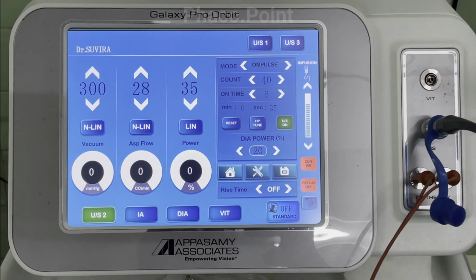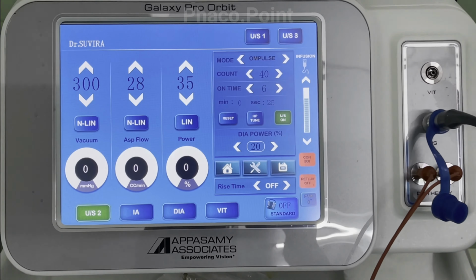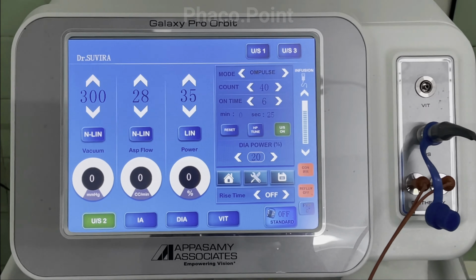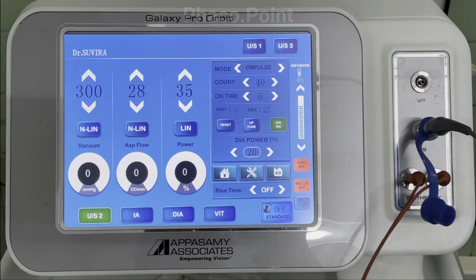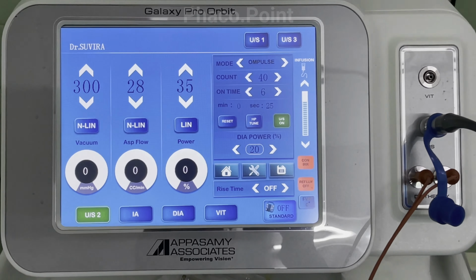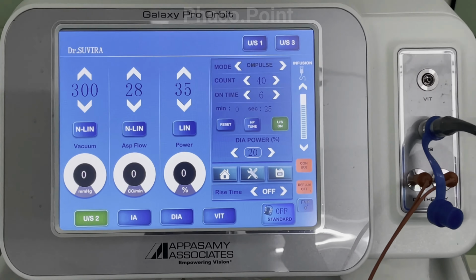Furthermore, let's look more closely at the power modulation used in this particular case. We know that we've kept the phaco power at a maximum preset of 35 in a linear mode, but if you look at the column on the right, the mode that has been chosen for this case is the occlusion micropulse. What that really means is that until you achieve occlusion, that is, before the tip is completely occluded, the power modulation in play is the pulse mode. Depending on how much the foot pedal is depressed, the power at that time is delivered 50% on and 50% off with every pulse.